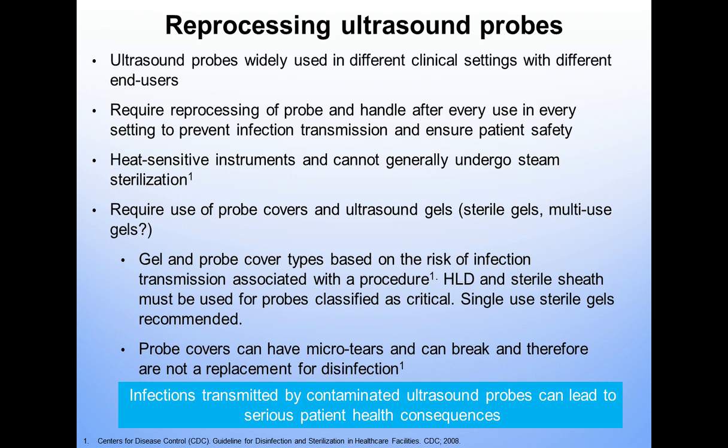If you do use a multi-use gel container, then you should be wiping it down with a low-level disinfectant between each client and ensuring that you clean those, because you're picking it up with your hands, and then you may have gloves on your hands. You remove your gloves and you wash your hands. I haven't talked a lot about hand hygiene here, but certainly hand hygiene is performed before and after every procedure.